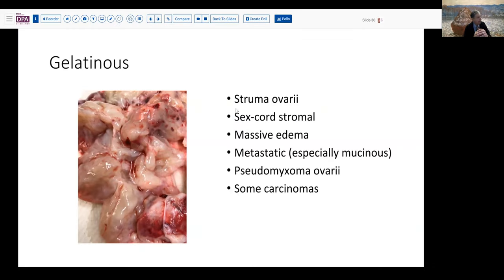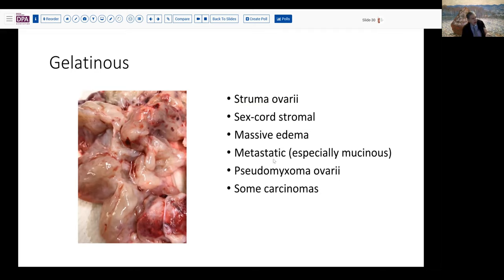The gelatinous pattern can be seen most commonly in struma ovarii and some sex cord stromal tumors, which can have a very mucoid solid appearance. Massive edema of the ovary can have this sort of glistening gelatinous appearance. Some metastatic tumors, especially mucinous tumors, as well as pseudomyxoma ovarii — essentially extracellular mucin to the extreme in the ovary — and some other carcinomas can have this pattern as well.